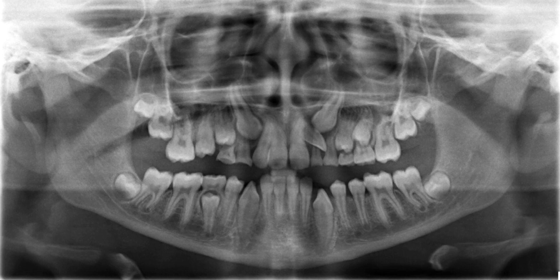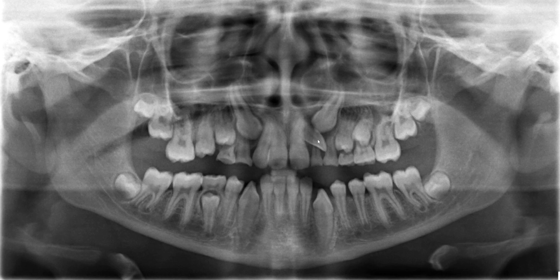Here you're looking at a 12-year-old female patient panoramic radiograph. If you pay close attention to the anterior maxilla, I want you to see the location of the canines as well as the lateral incisor. Both of these canines are mesially tipped — the crowns are mesially tipped, pointing toward the lateral incisor. On the patient's right side, number 7 is erupted, but on the patient's left it's abutting the lateral incisor, and the lateral incisor failed to erupt. So we have an impaction of number 10, as well as apparent impaction of both canines, 6 and 11.